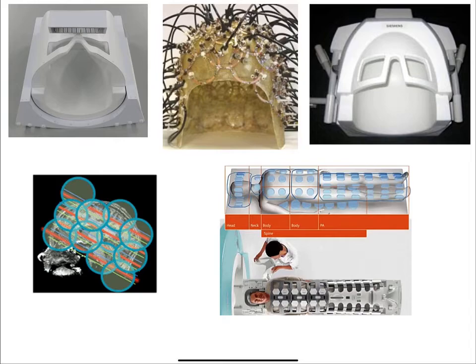So the first thing that happened in the late 90s or early 2000s was people realized: what happens if instead of having just one coil receiving the magnetization, you had lots of little coils? And this led to something called parallel imaging.